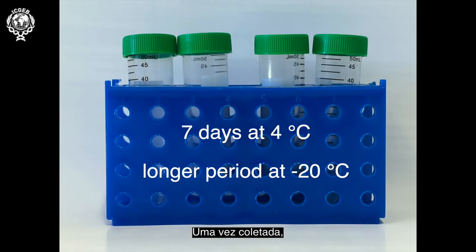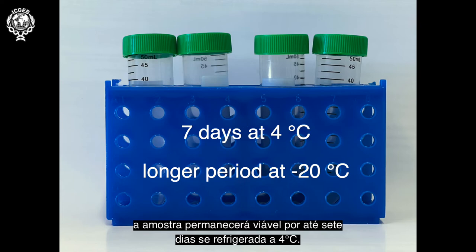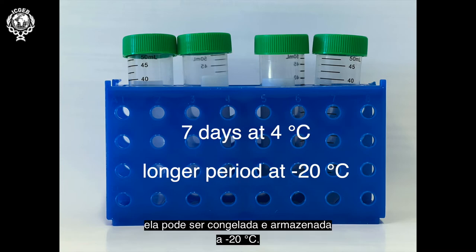Once the sample has been collected, although stable at room temperature for a short time, the sample will remain viable for up to 7 days if refrigerated at 4 degrees centigrade. Should the sample be needed for longer periods before testing, it can be frozen and stored at minus 20 degrees centigrade.